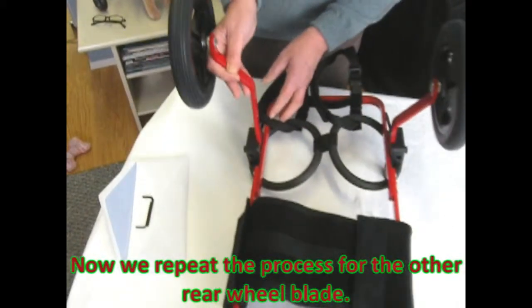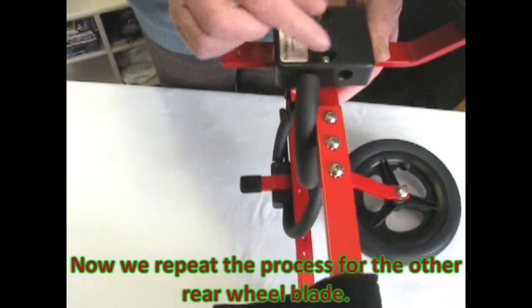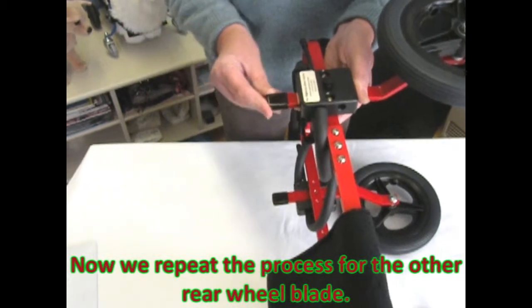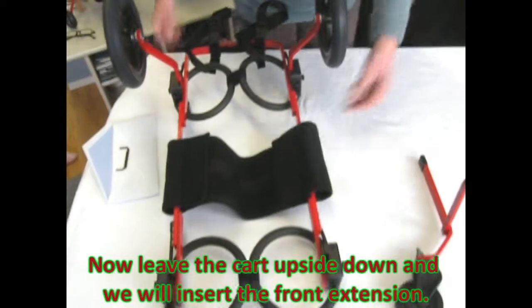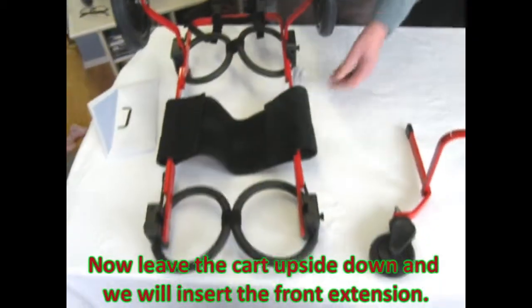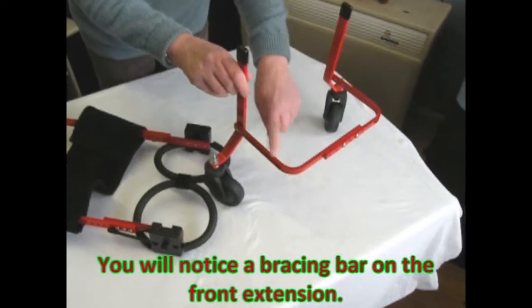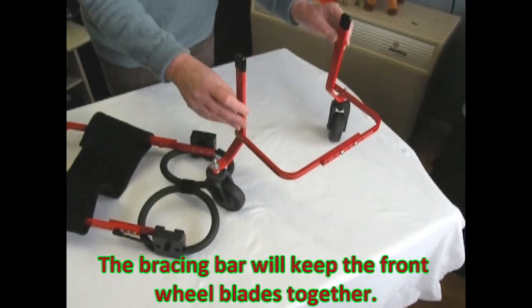Now we repeat the process for the other wheel blade. Now leave the cart upside down and we will insert the front extension. You will notice a bracing bar on the front extension. The bracing bar will keep the front wheel blades together.